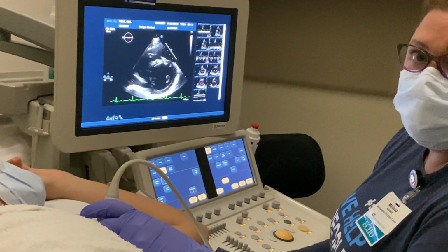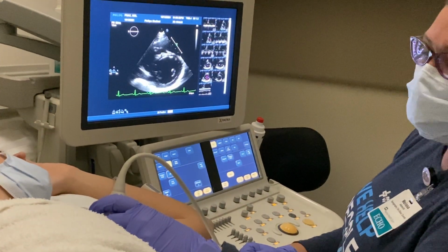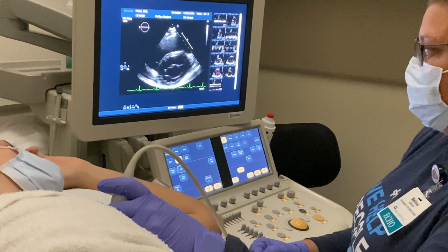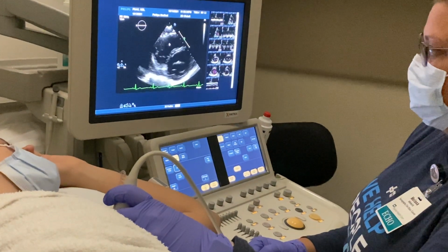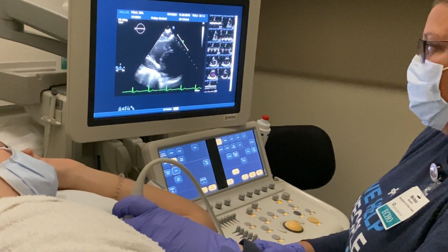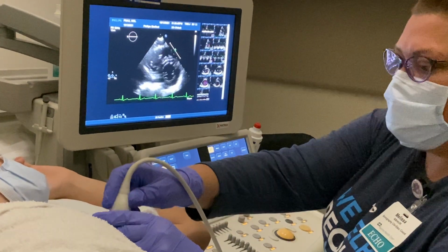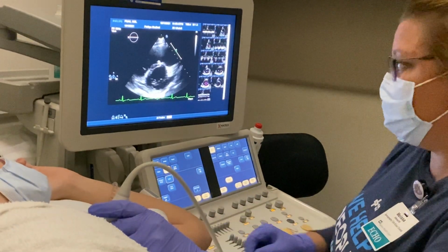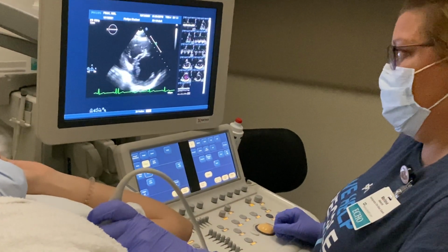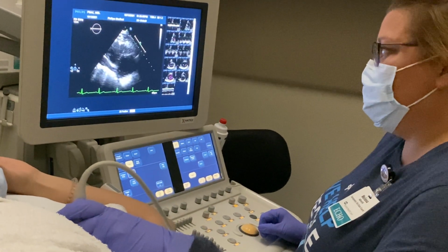Gotcha. Okay, so again, for the last picture, we're gonna be looking at the apex. So I like to call this an L maneuver. Okay, so on this one, I'm gonna just drop a rib space, and now I'm gonna move more lateral on the chest while my beam is still tilted towards the hip. Now this didn't fully cover it or do the trick. So it's not just one rib space, sometimes it's more than one rib space. So I'm gonna go down 2 rib spaces here. It's a little bit better. And now I'm gonna just pull a little bit lateral and tilt way towards the hip.